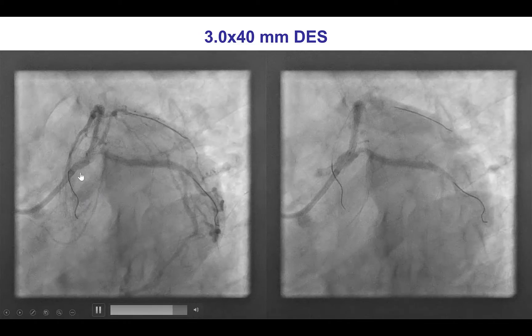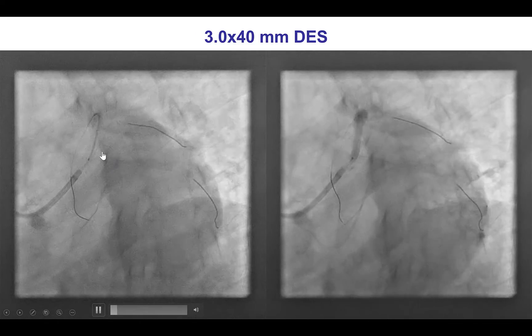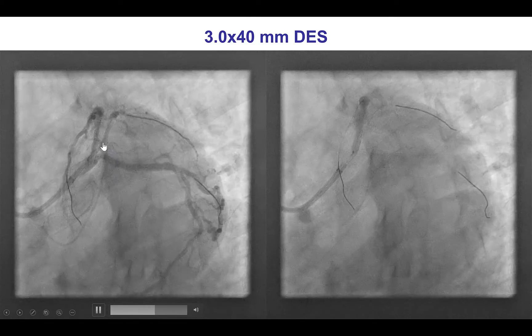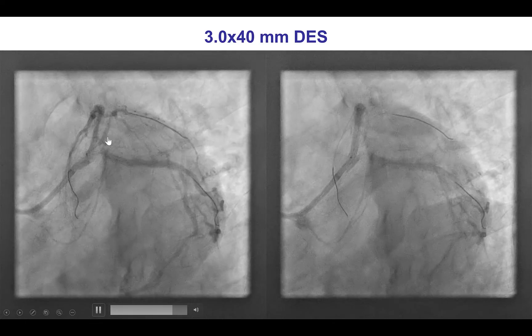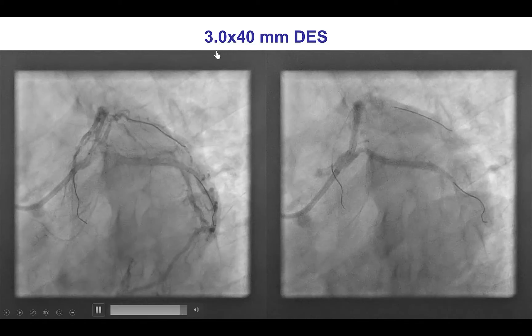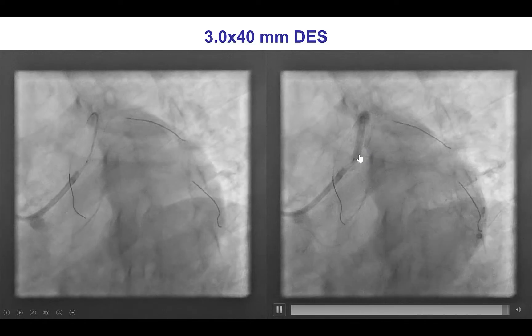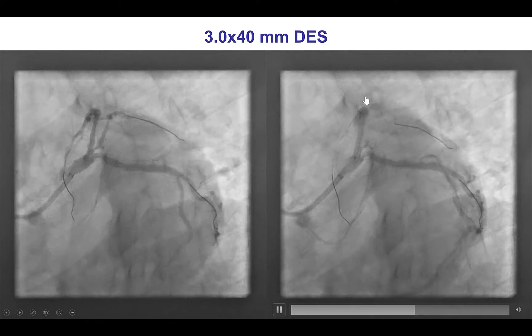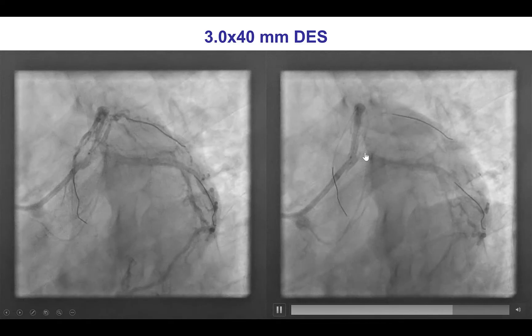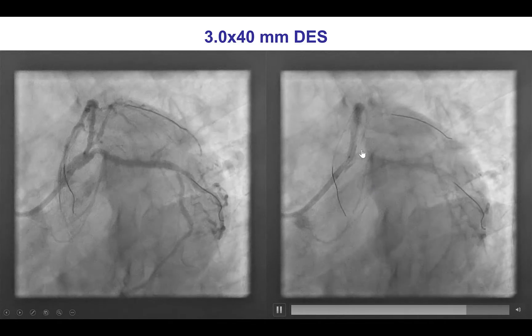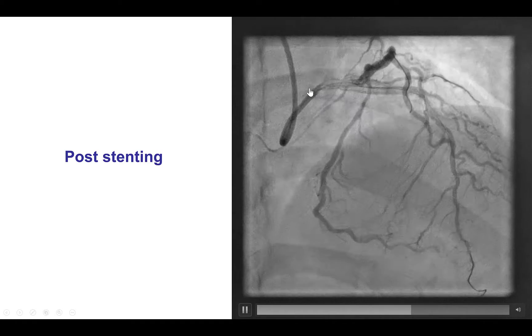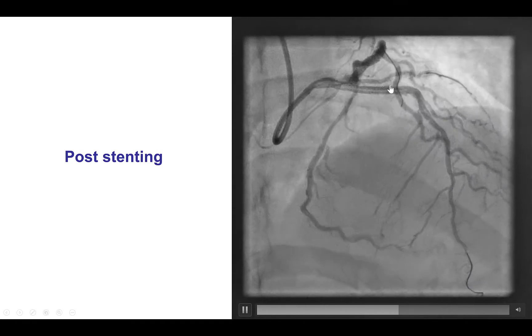This is a bifurcation — essentially a Medina 111. However, there did not seem to be significant severe disease in the origin of the diagonal, so we decided to use the provisional approach. We inserted a workhorse wire into the diagonal branch and deployed a 3.0 by 40 millimeter drug-eluting stent from the ostium of the LAD to the middle LAD. Our plan was to not place a stent into the circumflex, although immediately the ostium of the circumflex appeared to have some disease.